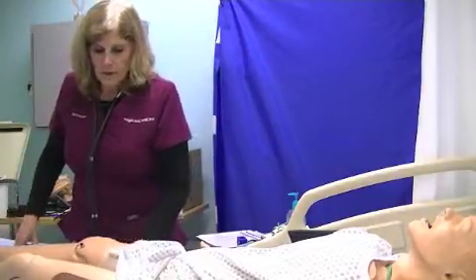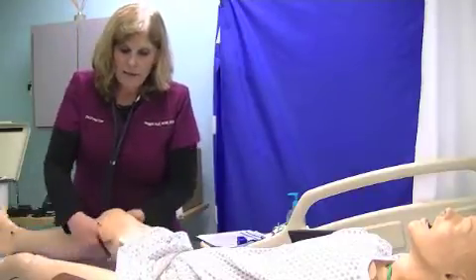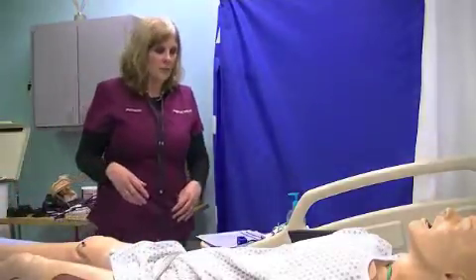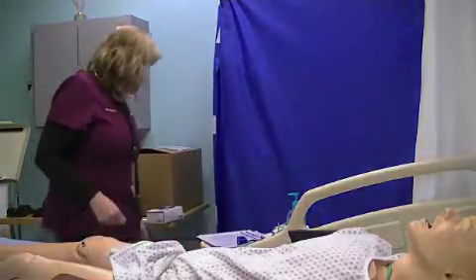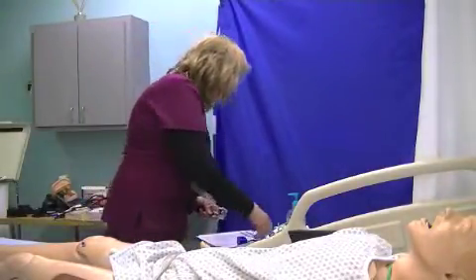So you can put it around right above the popliteal space on the front, and then listen at the popliteal artery. But you have to press it a little harder. It's a little harder to get that pulse there. Okay, so what we're going to do is make sure we got the pulse on. We're going to make sure our stethoscope is cleansed.